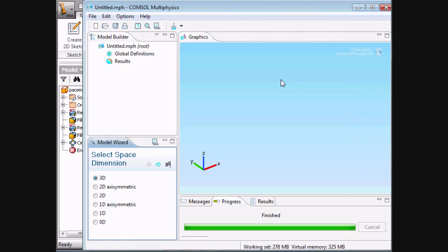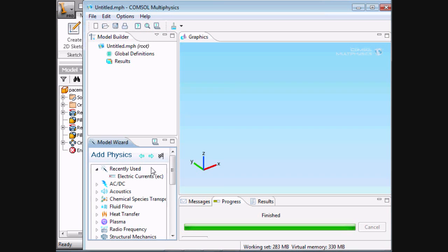We then switch over to COMSOL and we start a new project. And the very first thing it asks us is to select the dimension, and for the LiveLink interface we use a 3D interface. In this case we will be using the electric current physics interface.